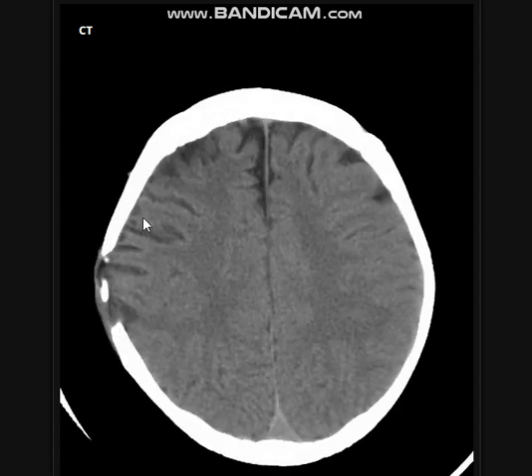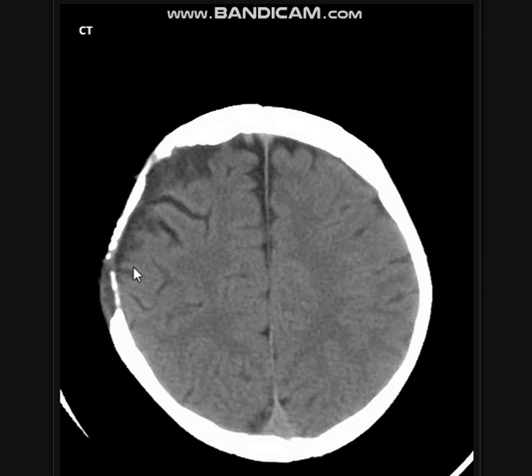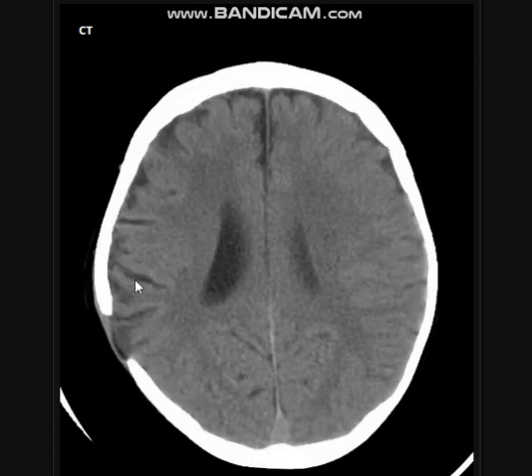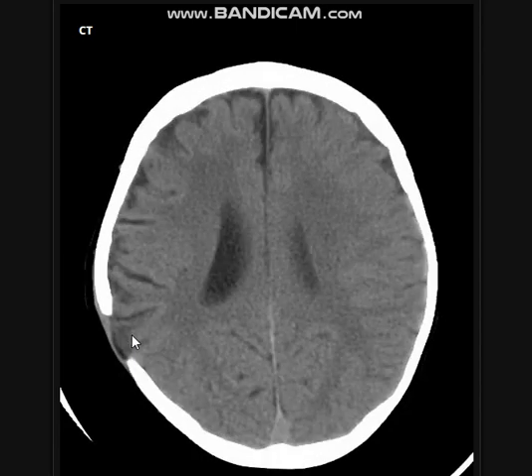Here you can see there is a small bulge of the leptomeninges, and part of the small brain parenchyma is pulsing through the defect of the bone we have seen before.